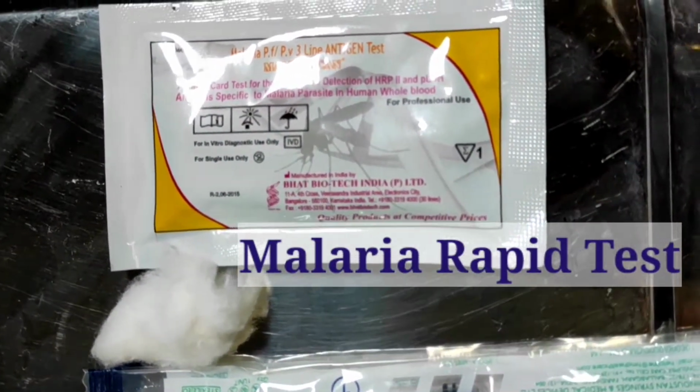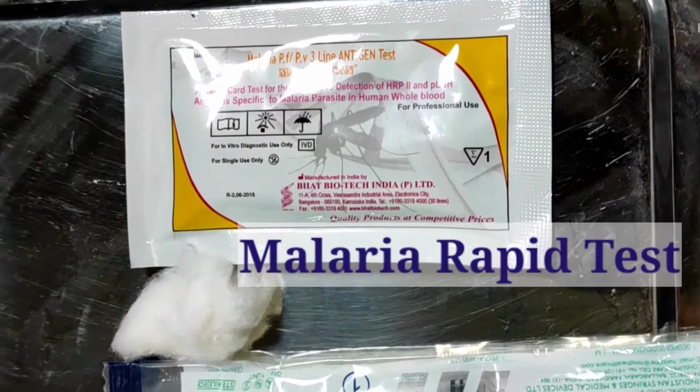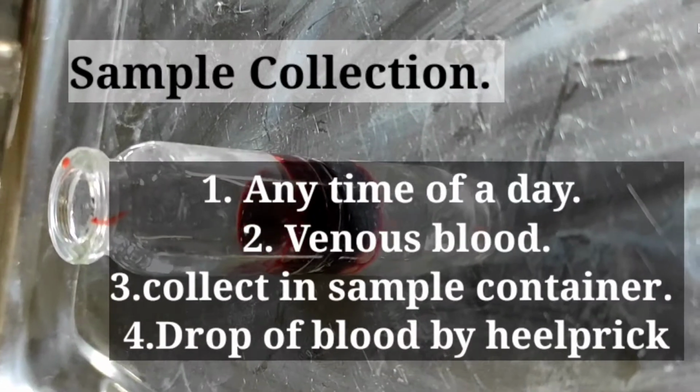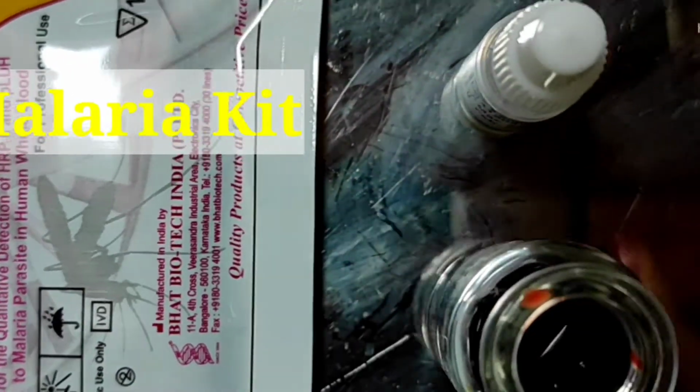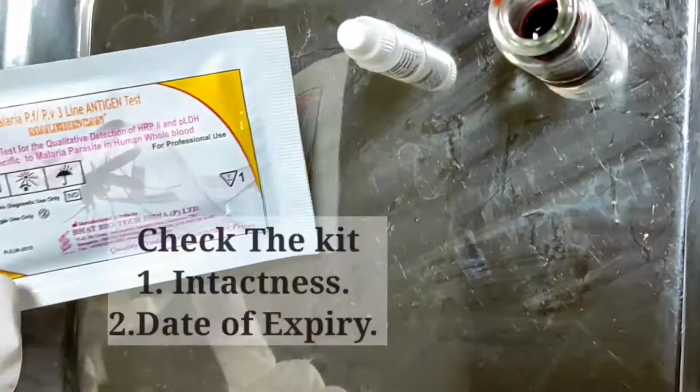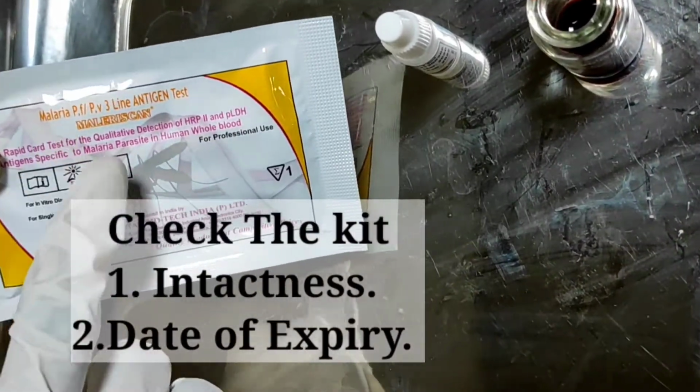Malaria Rapid Test. It diagnoses the malaria parasite antigens in a 20-minute test. The malaria test kit has 3 windows: C, PF, PV, and the sample and diluent windows.